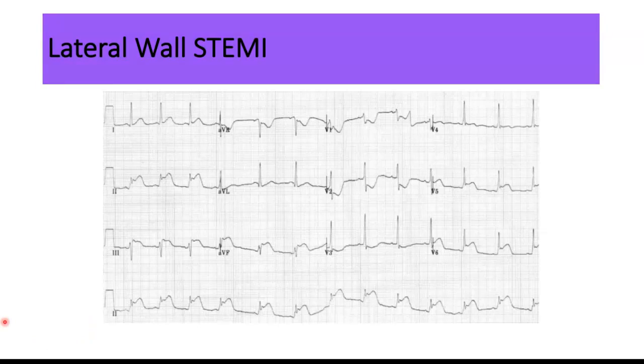When we look at V2 and we see this ST segment depression, we might consider a posterior infarction because there is a very large R wave. We will talk about this when we talk about posterior wall MIs. This constellation of EKG abnormalities is typically produced by occlusion of the proximal circumflex artery and potentially even the left main.